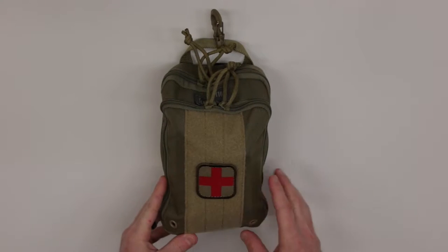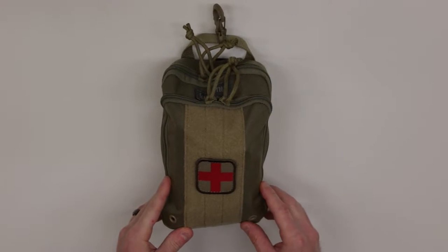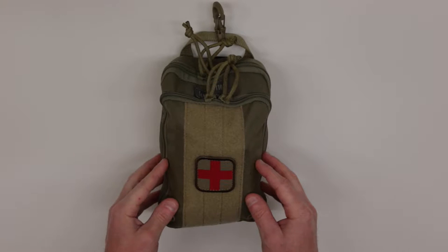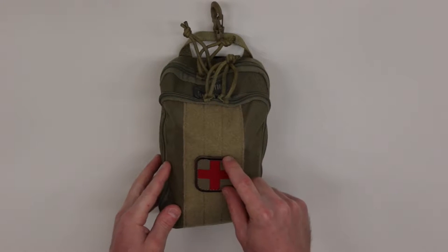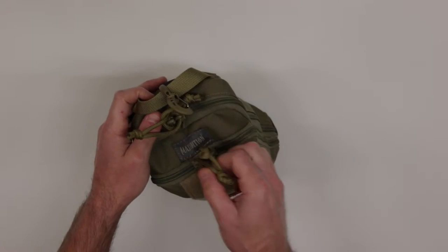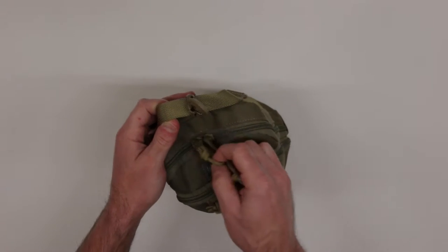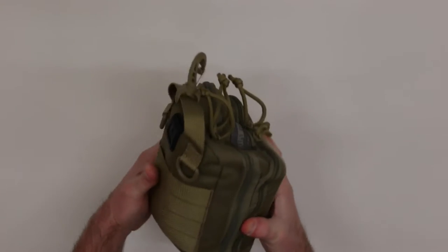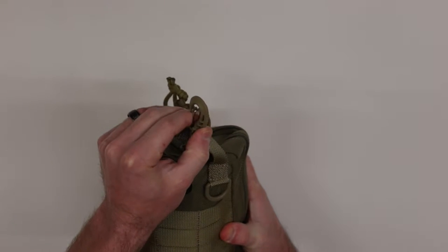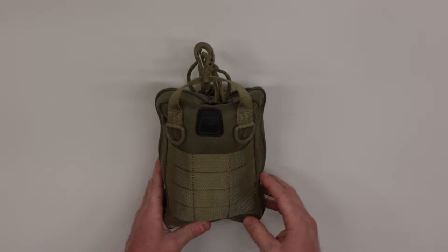Starting with the outside, it has a nice loop field on the front, and I have my medical patch here to clearly identify that this is a medical kit. I have multiples of these pouches, so it's nice to clearly label them. On the top it has two pouches with zipper pulls, a large grab handle, a zip hook for attaching to a D-ring, and MOLLE webbing for MOLLE-compatible gear.